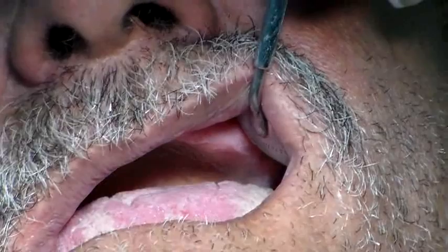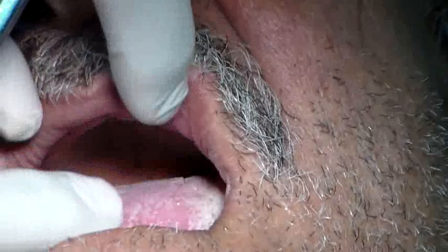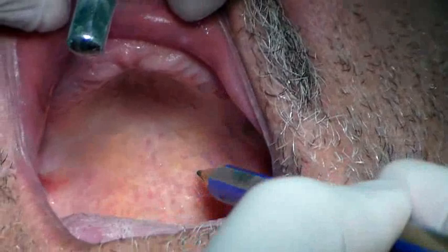Today we are going to have a look at the posterior palatal seal area. The posterior palatal seal area is an area that is developed on the soft palate. The soft palate is attached to the posterior part of the hard palate.